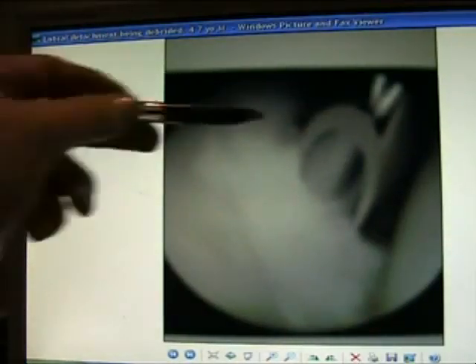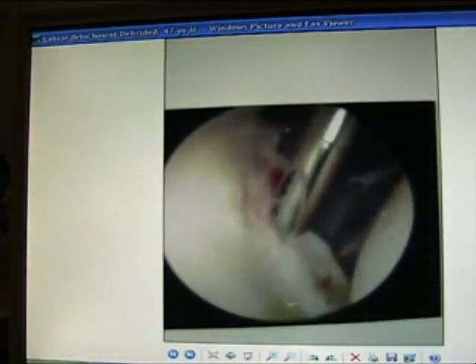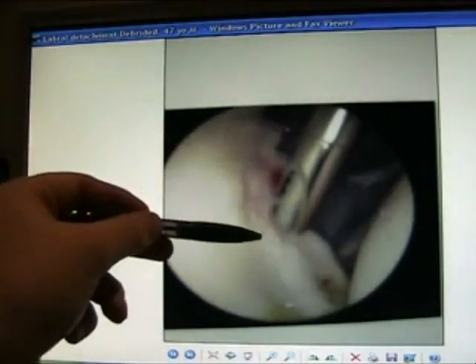Instability — posterior translation in the shoulder. Labral detachment in the shoulder — here it is, being debrided at arthroscopy.